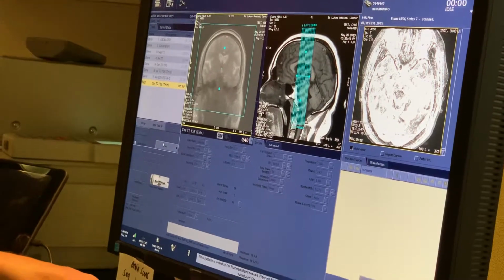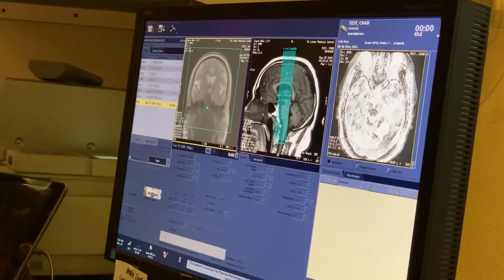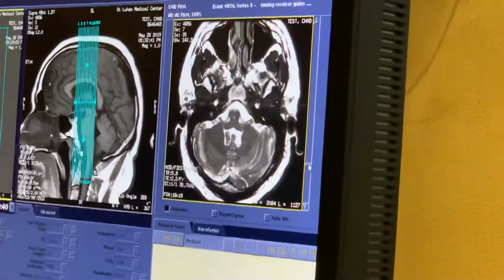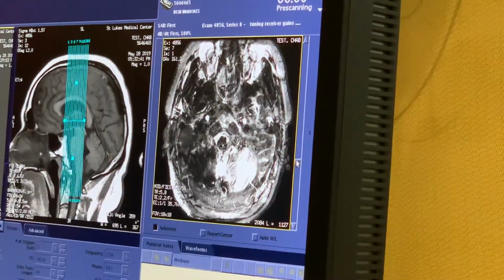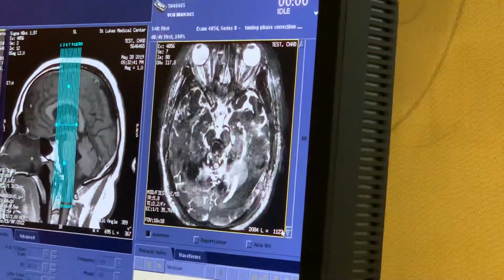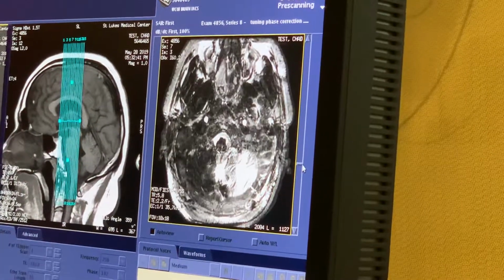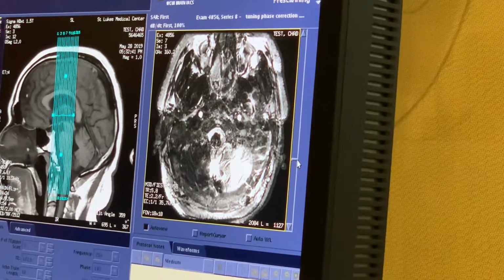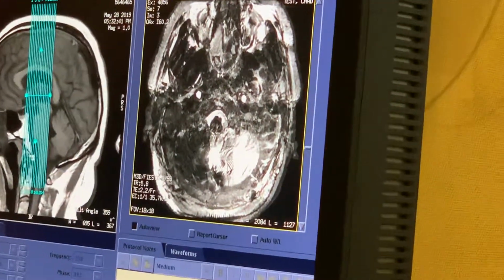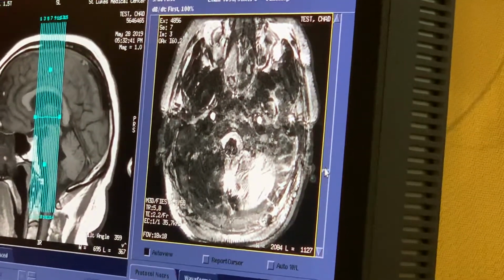All right, our next scan is about 1 minute, and you'll be all done. The Fiesta is actually fairly interesting in the fact that you have artifact at the top slices, the first slices, and the slices at the end, which is essentially the anatomy from the other side wrapping around. I'm not even sure why it happens, but I know it happens, so you have to add a few extra slices on the top or the bottom, because you get this kind of weird artifact happening.